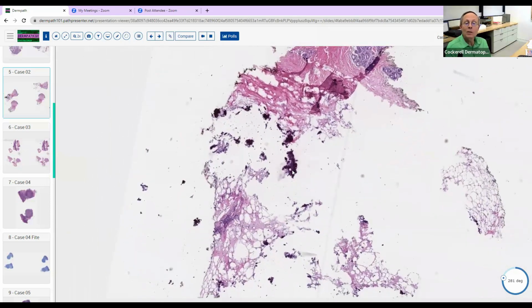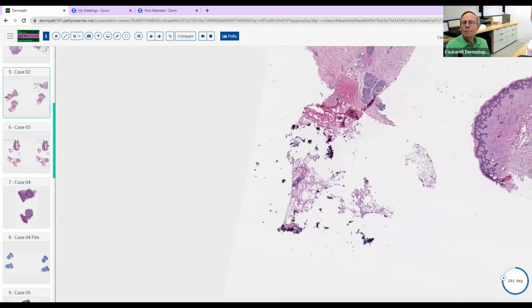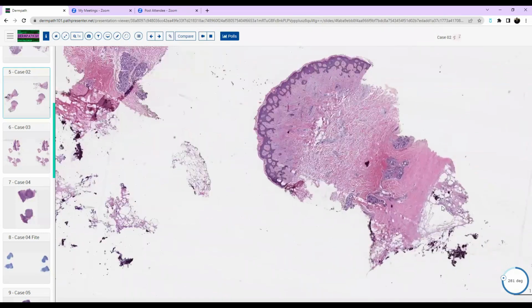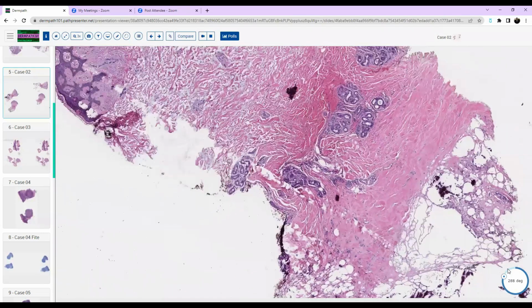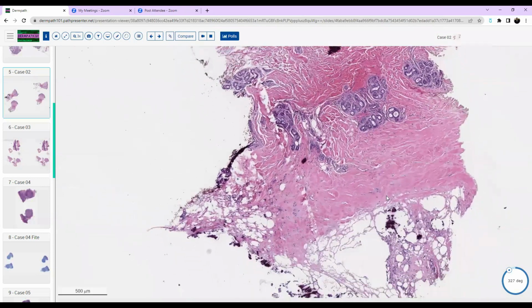Usually in calciphylaxis, you'll see a little fine stippling of calcium, and you can see it in the interstitium as well. But it's not usually confined. It can be confined to the fat if you get it early. But what's the other thing that you see in calciphylaxis that's not seen here? I was thinking mainly just the involvement of the vessels.